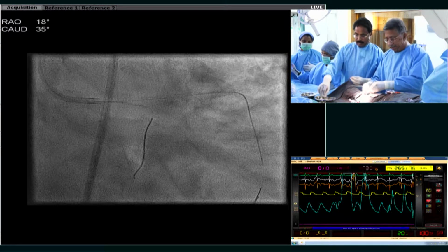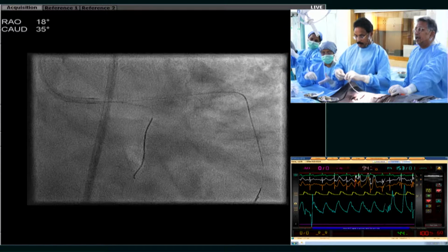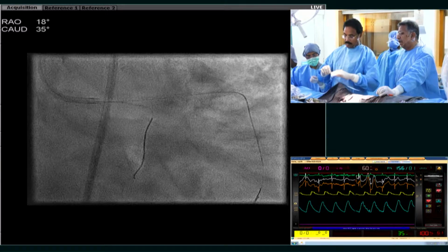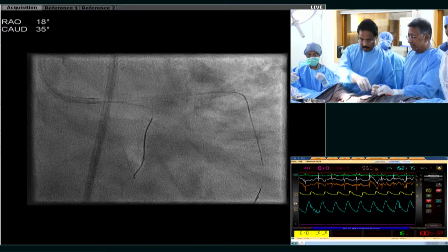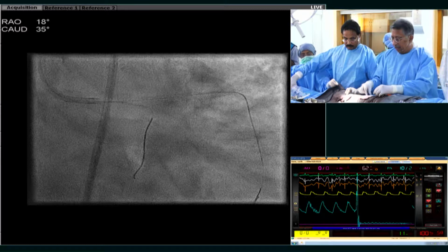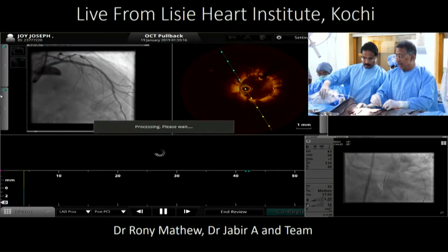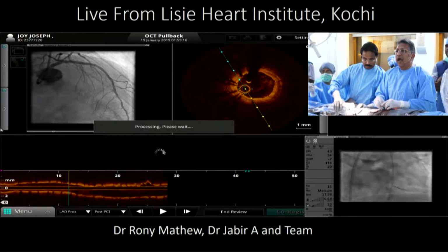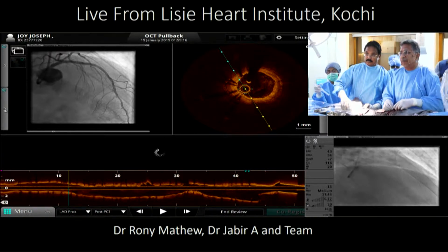So I will now do an OCT. Thread the OCT. Now this is, I think, an interesting point which Dr. Nicholas said. If we have a strut across the circumflex ostium like that with a large connector, can we go back to that view please? Get me that OCT view please. The stent is basically made up of crowns with connectors. So if you have a connector like that right across the left circumflex ostium, I think that strut should be removed from there because that's going to cause neointimal proliferation and restenosis at a later point of time.